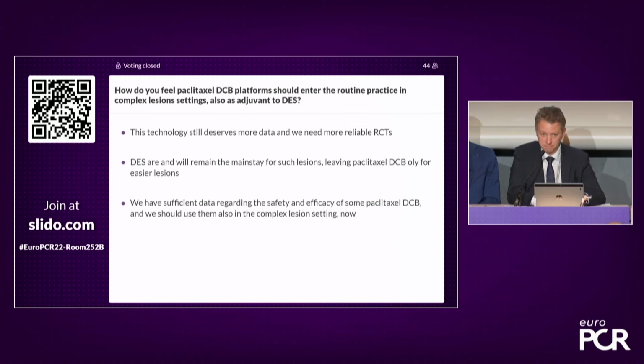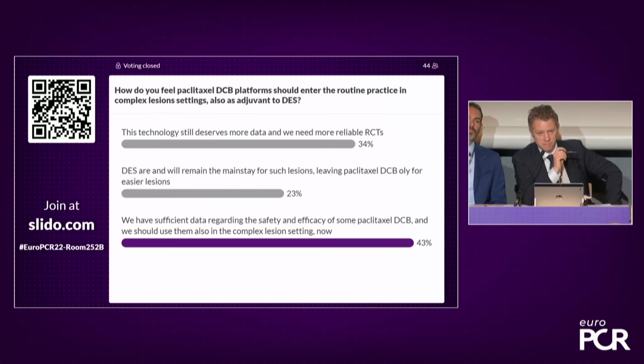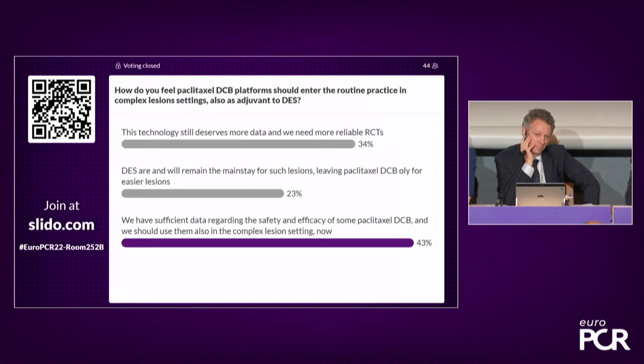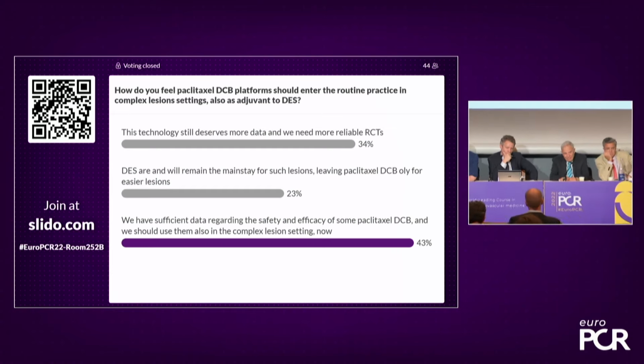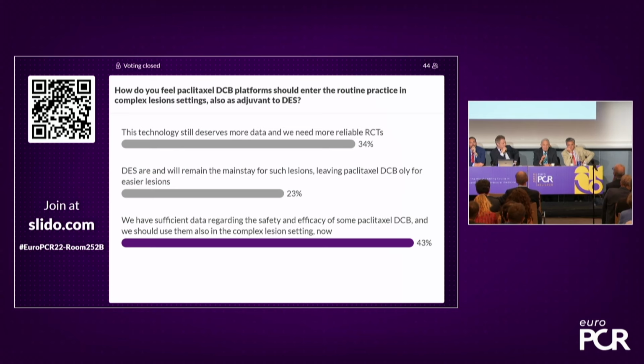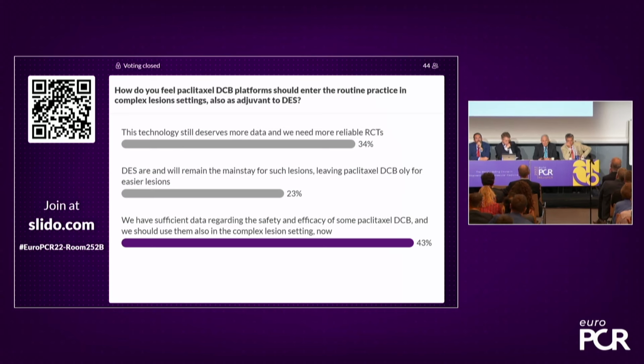Question from the back? Yeah, so those of us with gray hair who practiced for many years before the stents, we had 2 concerns. Restenosis was huge, but obviously drug-coated balloons can help resolve that. But the dissection was also big and scary. So I don't think there is enough experience to use drug-coated balloon and say that the dissection rate is okay compared to stenting. I don't think there is enough data.